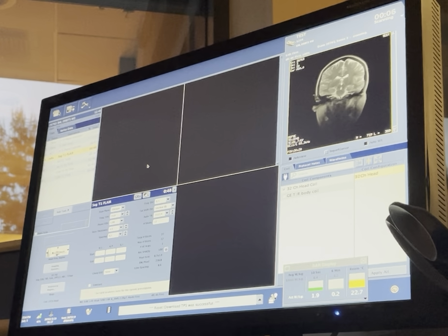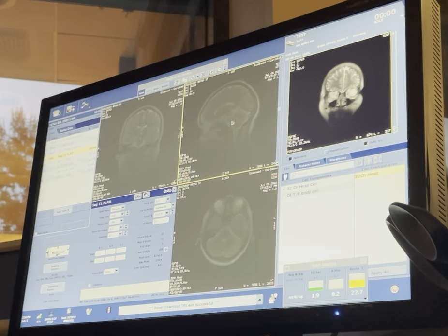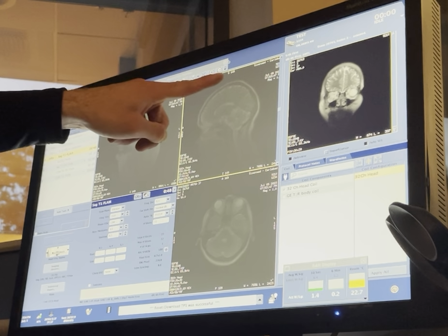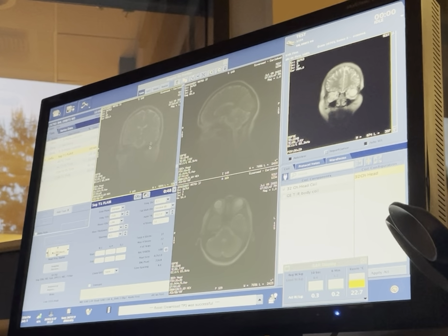Okay, so we're gonna do the same thing again. You're gonna find the globe of the eye on your sagittal, you're gonna find the globes in your coronal, and then, so here, click that again, click up here, make sure they're not, okay, we're good. So you can window them. I'll probably go left and down. Something like that. All of them? Totally up to you.